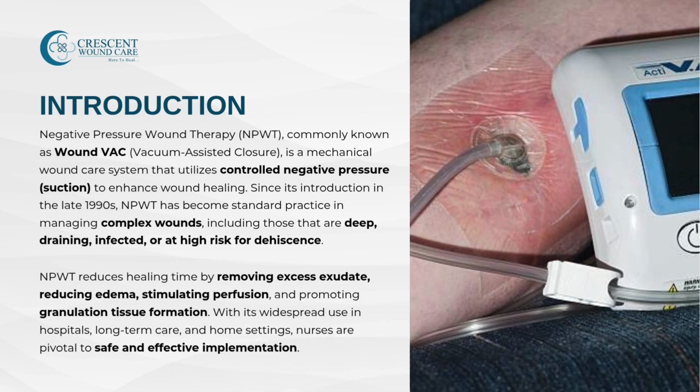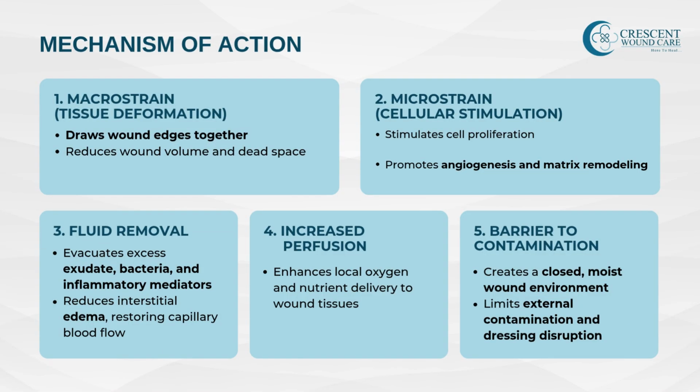As frontline caregivers, nurses are instrumental in implementing this therapy, from preparing the wound and applying the dressing to monitoring healing progress and educating the patient and family. In this module, we will walk through every step of this process. Now let's take a closer look at how negative pressure wound therapy works at the tissue level.